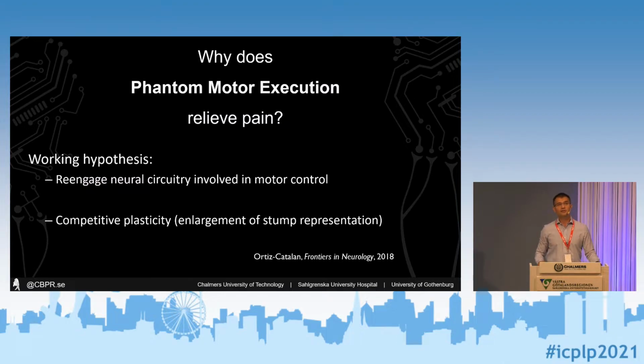A good side effect of myoelectric pattern recognition is that it's not perfect. It's actually quite bad. If you have ever tried myoelectric pattern recognition, it takes a little bit of time to get you to be able to move the hand. So there are certain learning aspects, and that makes the patients really focus on how they are using their muscles.